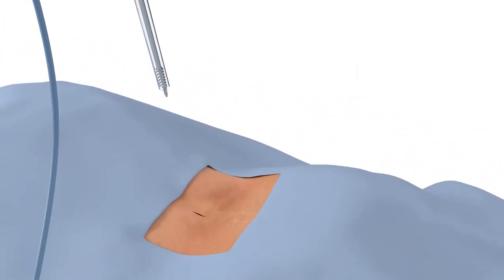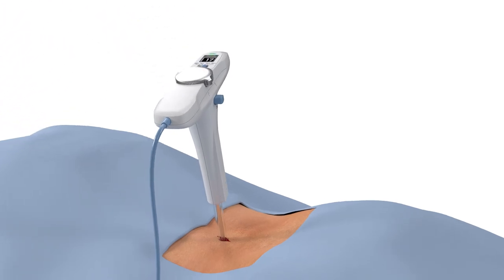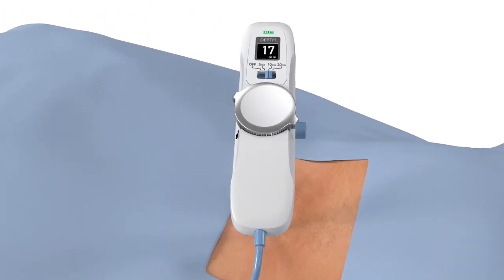The all portion of the device is placed at the entry point of the pedicle and can be malleted for advancement. A 17mm initial depth is displayed on the digital screen and a flashing green light indicates no triggered EMG nerve detection is occurring.